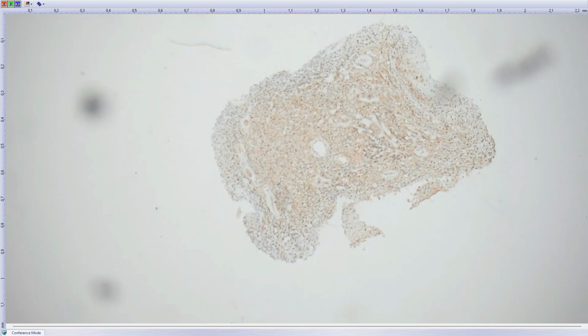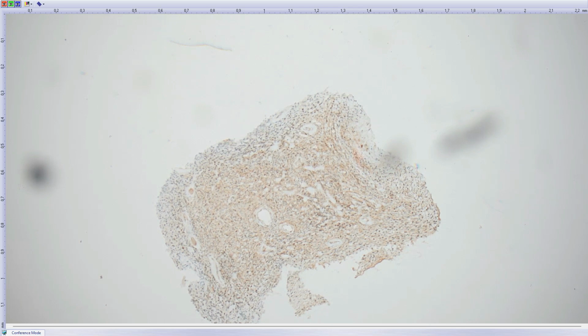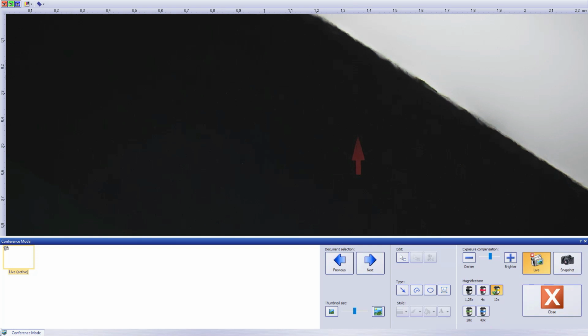So SFT was definitely on the table, but for me, this focal STAT6 positivity would be more in keeping with GLI1 amplified tumors, where the GLI1 gene, which defines these tumors, is very close to STAT6, and when it is amplified, there is often amplification of STAT6 as well, leading to this focal positivity. So I was suggesting this is either a benign or low-grade malignant tumor, potentially GLI1 or SFT.